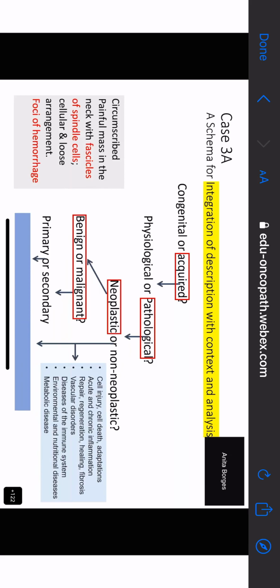What, Vimi? Have I made up this description or did you describe it the same way? Vimi, you also disappeared. Ma'am, I actually didn't describe it as cellular and loose areas. I'm sorry, Vimi, but how did you reach the diagnosis of a schwannoma? The same way as when I described it, right? So have I described this wrong? No, ma'am. You saw what I saw, and yet your observations and your description were different from what I described. So I must say, Limpy, you made the diagnosis of schwannoma. That is excellent. So this is, yes, a schwannoma.